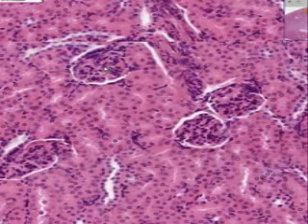Here is Bowman's parietal epithelium. The cells in here which surround the capillaries are Bowman's visceral epithelium, also called podocytes. And some of these cells, which are more common towards the vascular pole, perhaps here and here, but you never really know for sure, are the mesangial cells, which are the so-called scavengers or immune cells, or perhaps macrophage-like cells of the glomerulus. And I really don't want to get into kidney any further than that, because we have identified all the major structures, and you really can't identify any more in H&E.